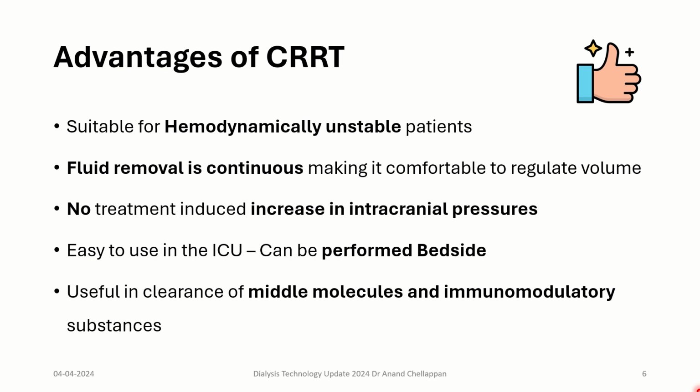CRRT does not induce an increase in intracranial pressures. So it is useful in patients who have neurological insults. It is easy to use in the ICU since it can be performed bedside, whereas intermittent hemodialysis and slow low efficiency dialysis require separate infrastructure, RO water, and may not be possible to perform bedside always.